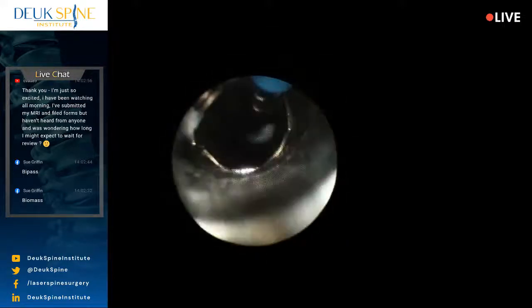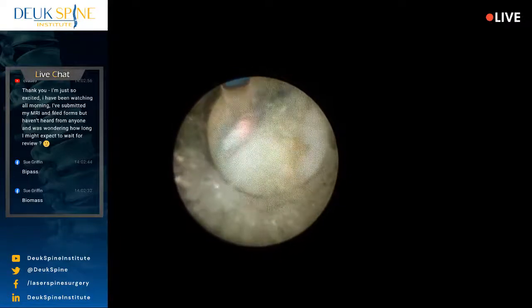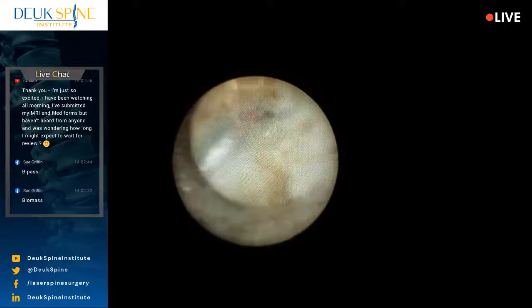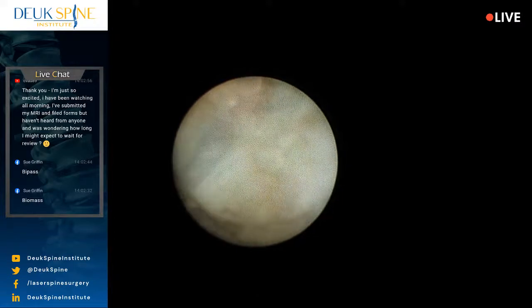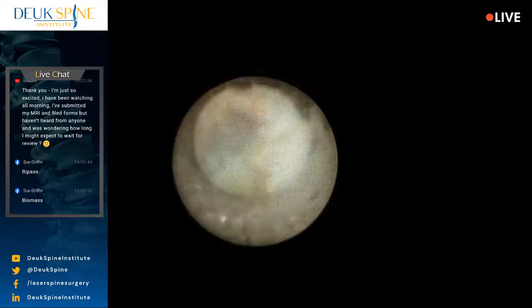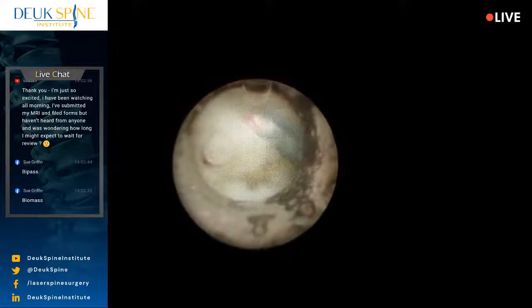By the way, these are all little herniations coming out of the foramen, in case you weren't aware. That's the nerve down there. So there's not as much herniation on this disc as there was on the last one, so we're not going to be getting as many big pieces out as we did last time, but we will get a few, and I think we've gotten most of them already. So I'm just cleaning things up.